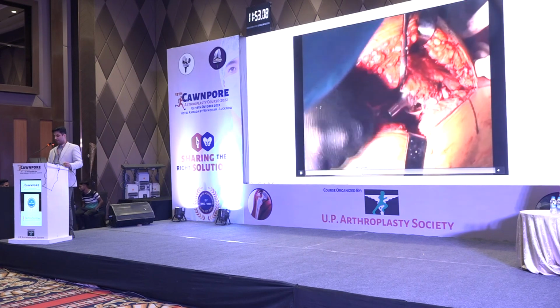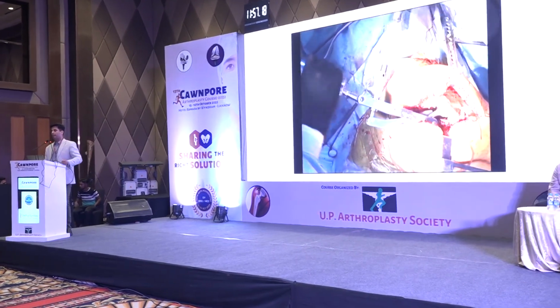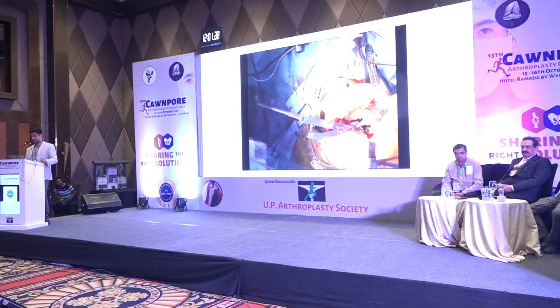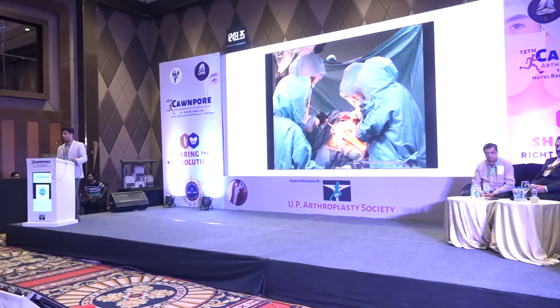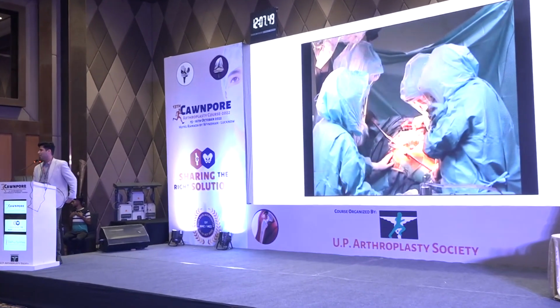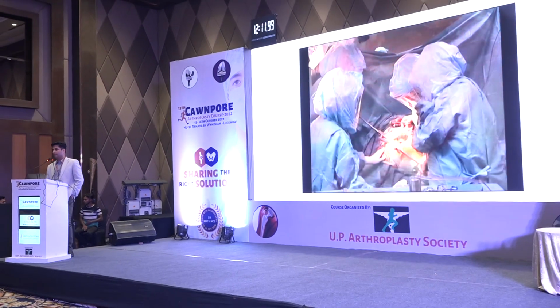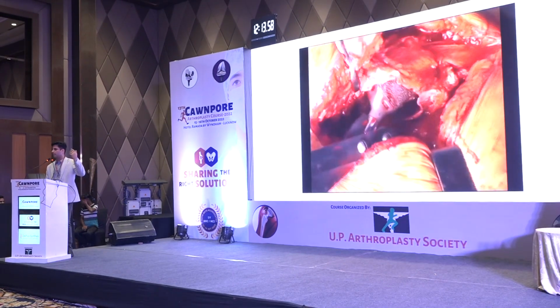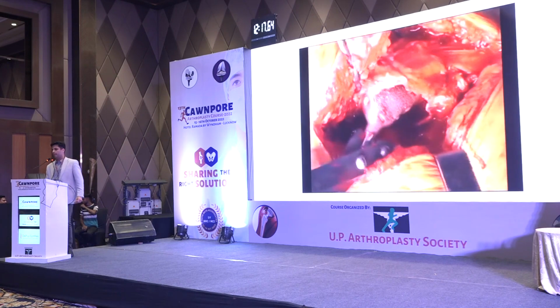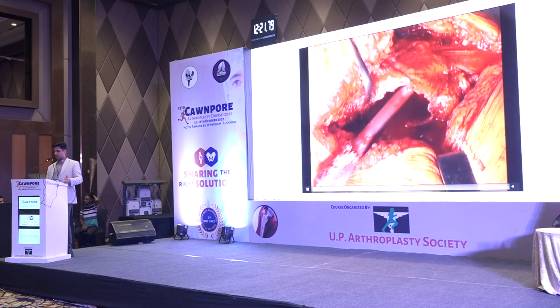And after you've created space, you can check whether it's amenable to an extracting device like that, which you can just punch in and punch out repeatedly. And with a good bit of practice and a fair amount of luck, you may actually manage to pull the whole thing out in one piece. Sometimes we have seen that the proximal fragment comes out separately along with it. So be prepared for surprises here in revision scenarios. So if it's proximally coated alone, this is something you can do.